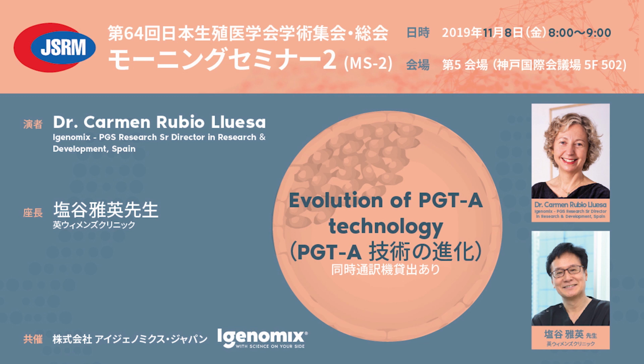So we are not reporting mosaicism in the media. We are just classifying the embryos as normal and abnormal. We are going to give the classification in this grading system, green, orange, or red. No mosaicism considered in there. Also, because when you have a small amount of contamination from external DNA, the profile can look like a mosaicism, and it's not a real mosaicism. So it's not going to be really accurate if we want to say this is a real mosaic or not.